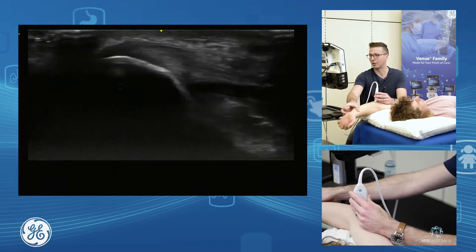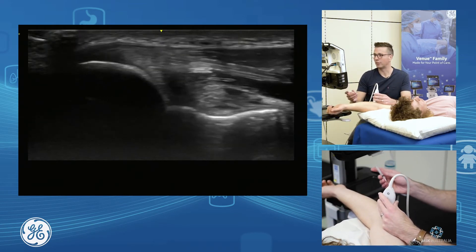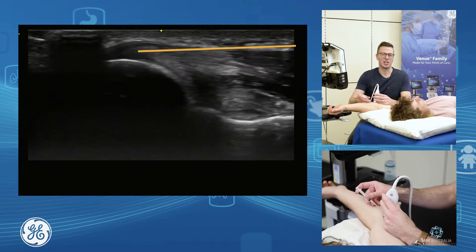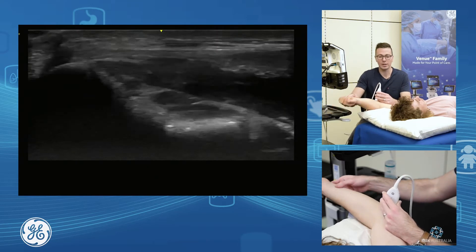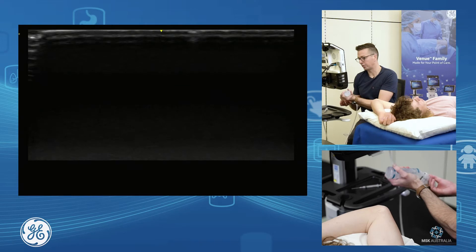He needs a lot of extension to really get the nerve out of the way, so I might position his arm out here to get the ulnar nerve out of the way and then do my injection. I can drop a needle in, I can inject, dry needle, inject intra-tendinous agents, or inject peritendinously, depending on what your aim is. So that's our common flexor assessment and common flexor injection.